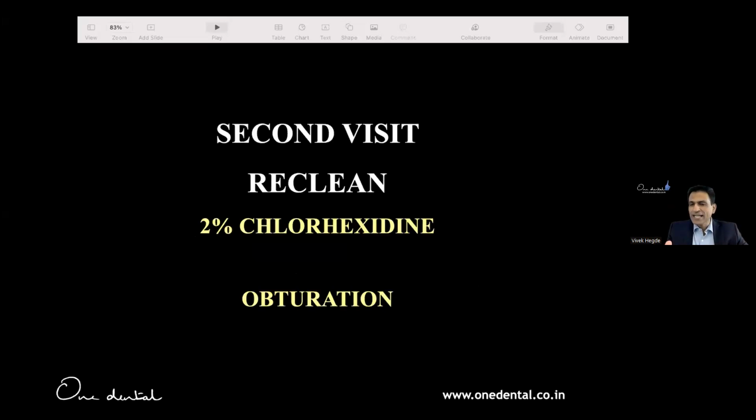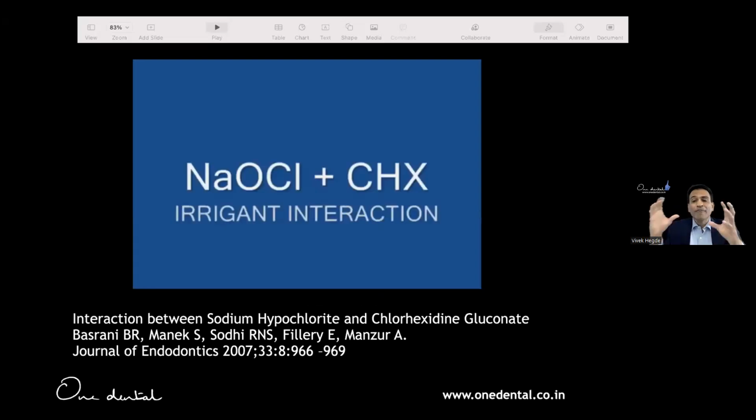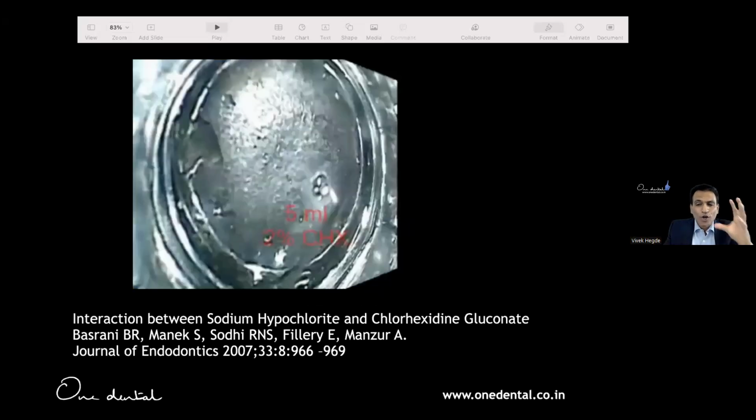Second is to reclean it. Some say I only use hypochlorite. You can do that. I do that sometimes. But in the chronic lesion, I like to give another irrigant there. It is called chlorhexidine. They can use. But my only request is, see this video, never ever mix chlorhexidine with hypochlorite.